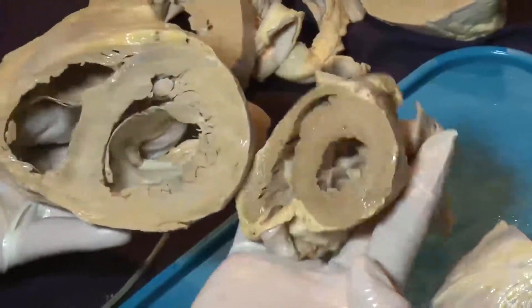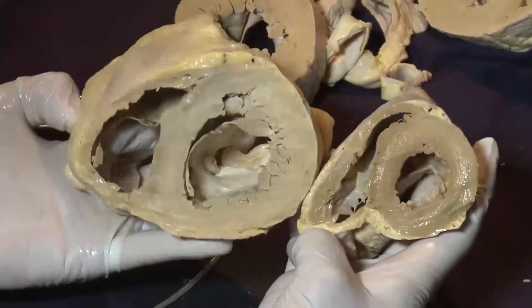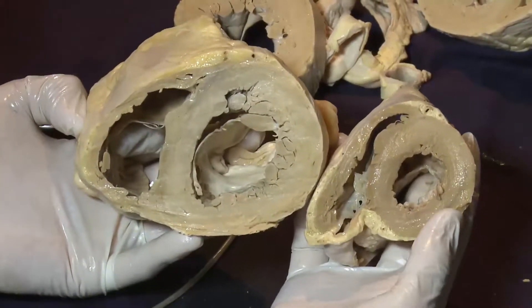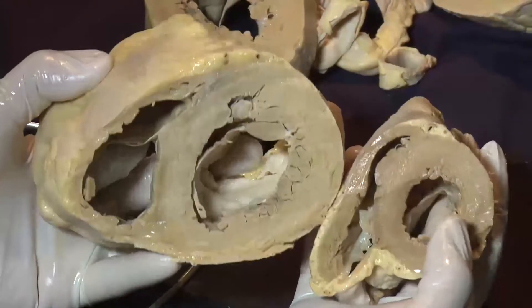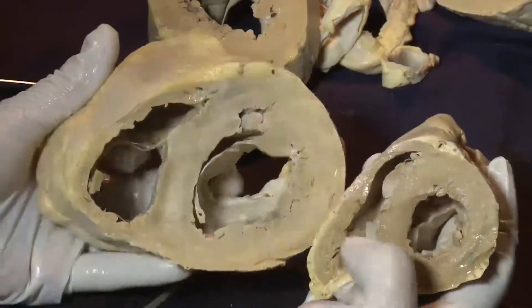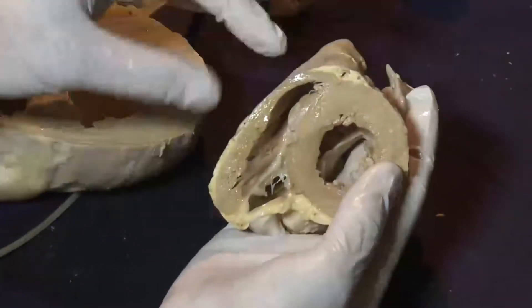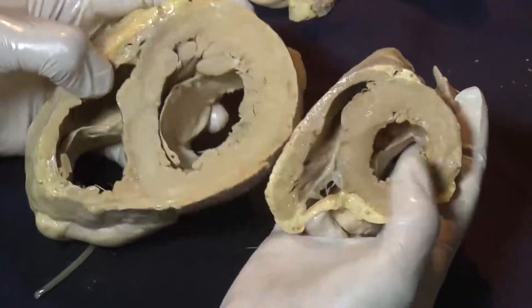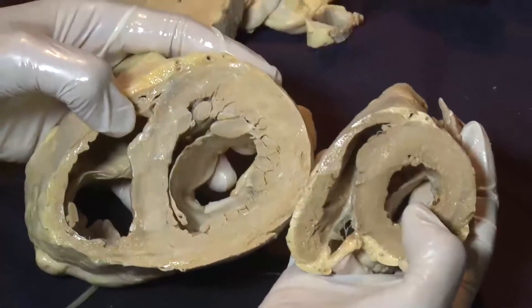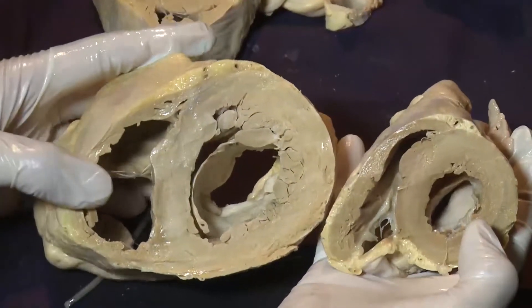Now we are comparing these two hearts. It's almost immediately clear to see the difference — we can see the right ventricular apex as a thin-walled, volume chamber compared to the left ventricular chamber shape, and so on. This is our standard procedure.